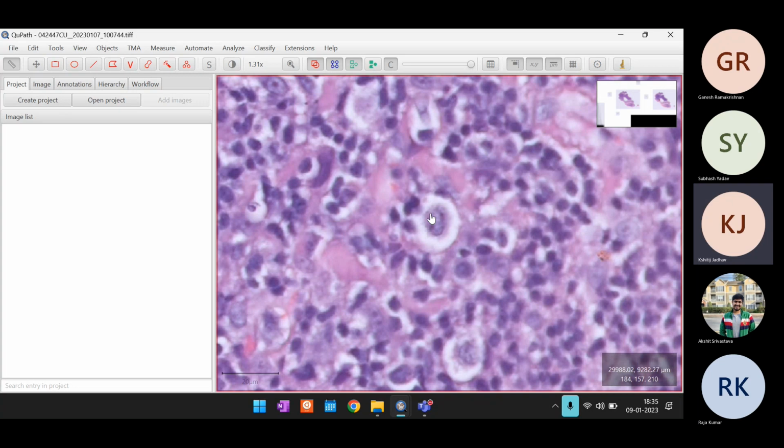This is good. So we discussed 3 or 4 labeling functions in the CD30, but we have another labeling function in this image as well. Now the question is how do we combine them, because they are 2 different images.